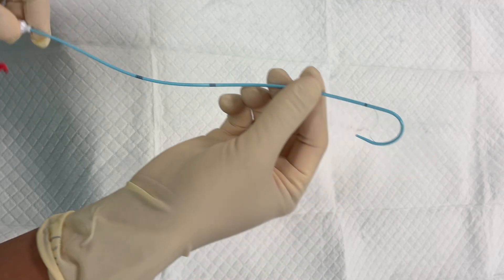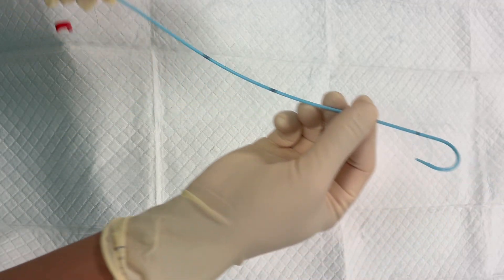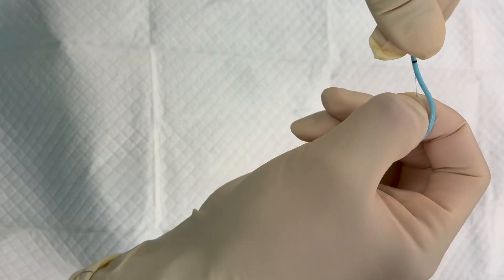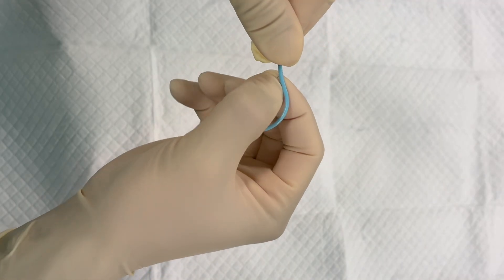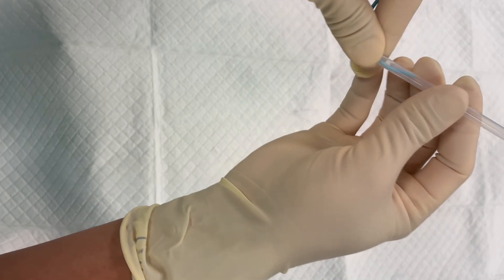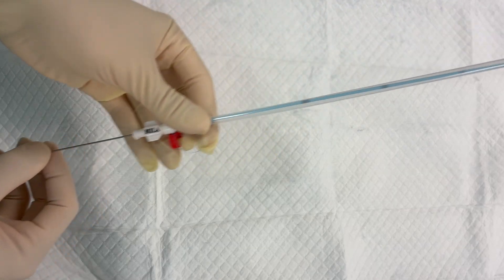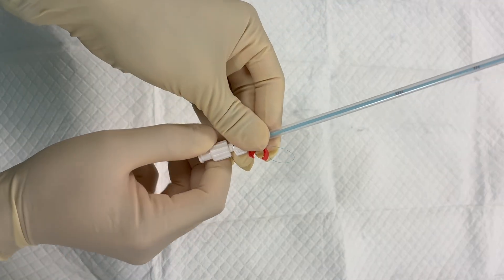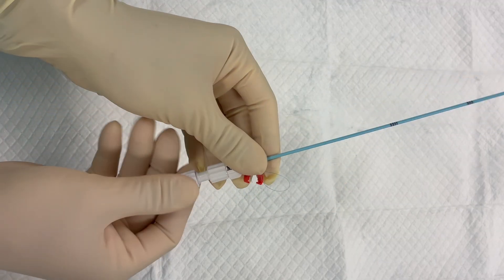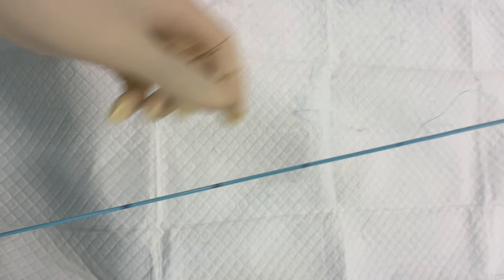First, we're going to prep the device. We're going to pull the locking string at the end of the pigtail to loosen the tip and allow the catheter to straighten. Next, we will slide the stiff plastic sheath over the curled pigtail tip to straighten it. Then we'll insert the cannula over the straightened catheter, remove the sheath, and apply the needle.